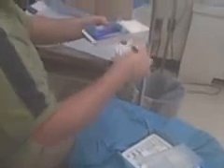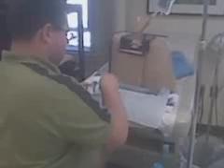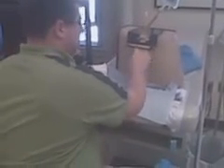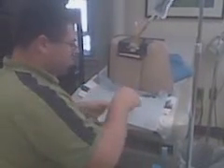We take out our little kit to clean up the back. Pop open our PI solution, squirt it in the bin here, throw this in the trash. Now we're going to take our swabs, stick them right in, cleanse the area, starting at the insertion site and going outward. And you'll notice it's going to be cold. I probably should have warned them beforehand. It's going to be cold, wet, and it may actually give you a bit of a tingling or crunchy sensation there. Then the third one, I'm going to hold on to my gauze. I'm probably going to leave that in just a little bit.